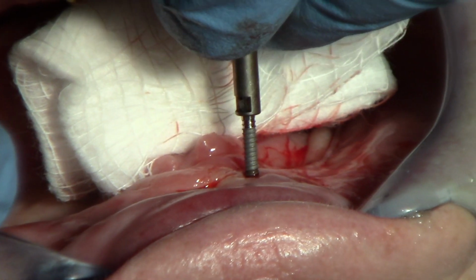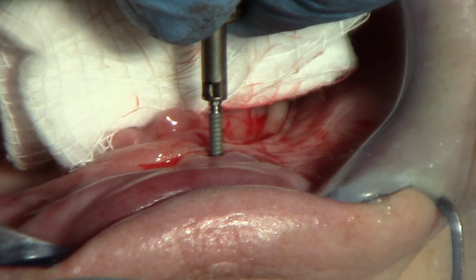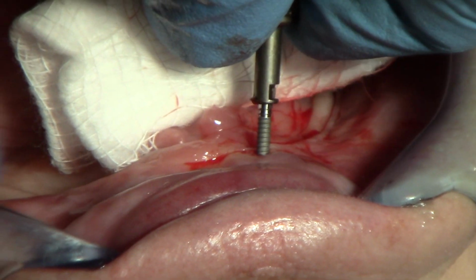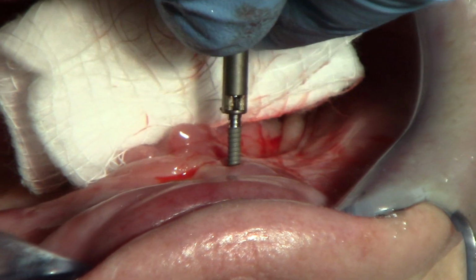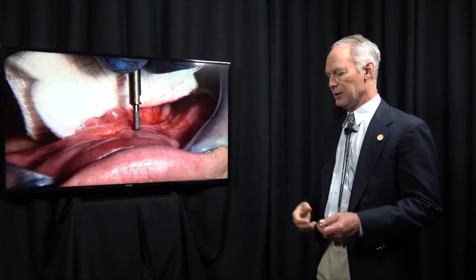So this is a 2.0 millimeter implant. Now normally on the mandible you use 2.0. On the maxilla, with this particular brand, you use 2.5. Now with 3M, we used a 1.8 or a 2.1. And then in the maxilla, we used a 2.5 or a 2.9 millimeter diameter implant.